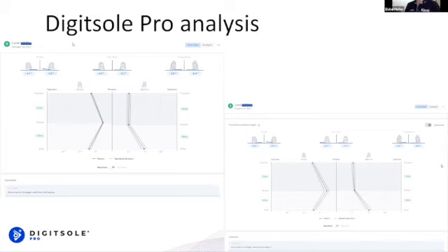What you also see, when we look at the degrees of the ankle when she strikes with the heel, is that the angle of her left foot is -4.1. So she's actually at a lower degree than on her right side here.